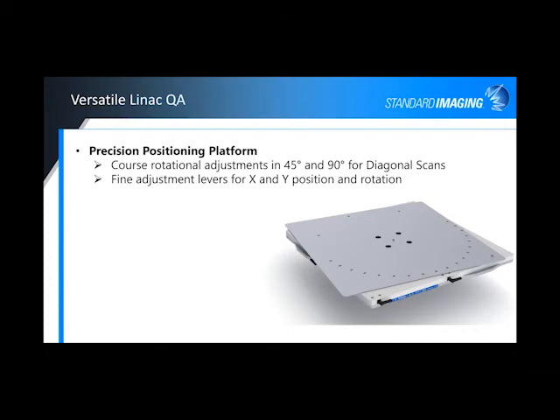There's a versatile positioning platform that gives you rotational adjustments — if you want to do your diagonal scan, you can rotate and lock in at 45 degrees or the 90 degree positions very easily. There are fine adjustment levers on the outside edge of the platform: one for the X direction, one for the Y direction for fine-tuning, and one in the corner for rotational. So it gives you the ability to really fine-tune and precisely move that phantom into place.